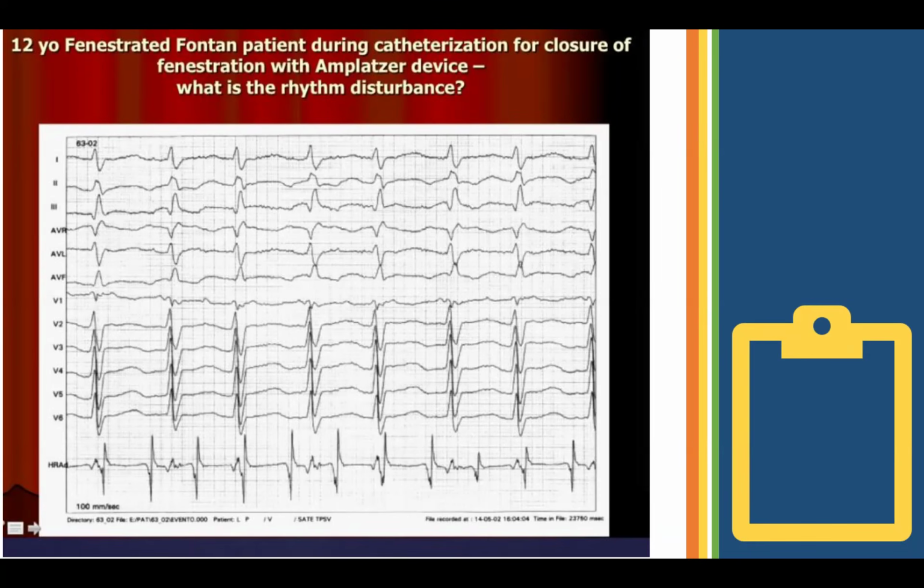So looking at the high right atrium catheter, thank you for again mentioning that it is there for me to look at. It does look like, where that P wave was that we initially thought we saw, there is a deflection in the high right atrium, and we see that kind of trending through. So there are P waves, although they don't particularly seem to be associated with the QRS that you can also see, if I think I'm on the right track.